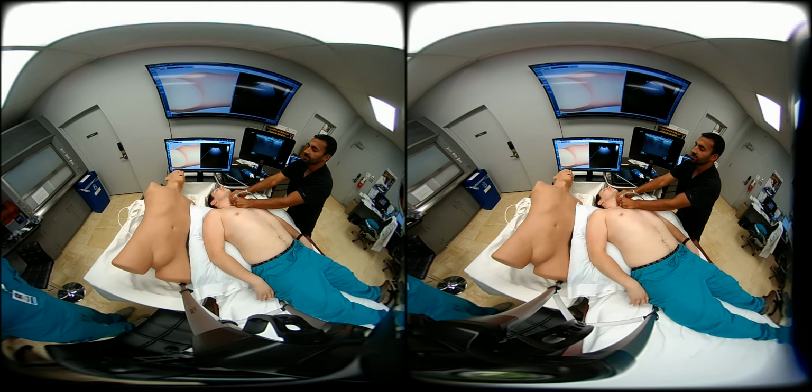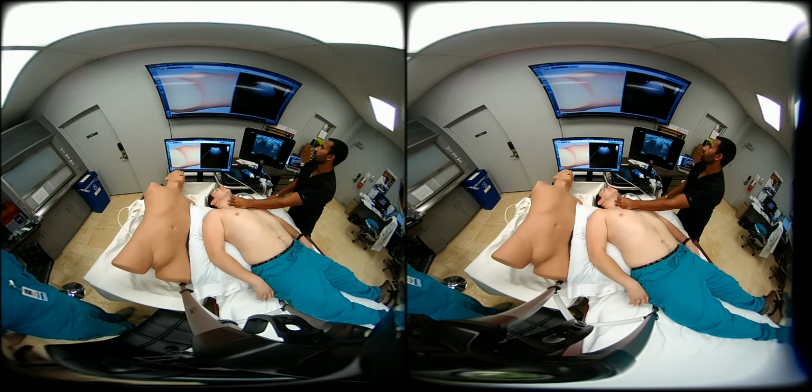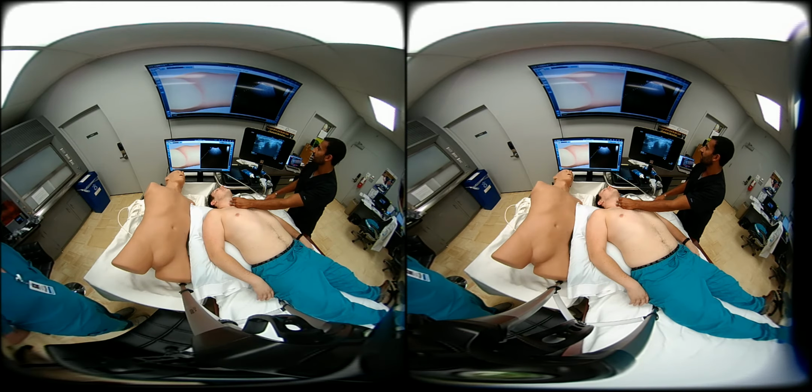So two strategies: starting off with a transverse approach to get identification of the trachea, useful again to evaluate for the expansion or alteration of the shape of that trachea. If we have an endotracheal intubation, we're trying to identify the balloon of our endotracheal tube. It's a useful technique to just scan up and down in the transverse approach. You can also identify the esophagus in that technique.